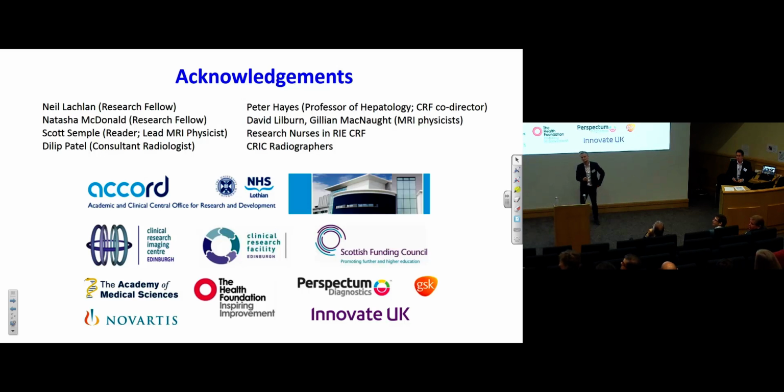Thank you for that. That was really interesting. I was just interested, you started off your talk mentioning the limitations of liver biopsy for misclassification of patients, and then you went on to talk about, if I understood it correctly, a diagnostic accuracy study of this multi-parametric MR using the same flawed reference standard. How do you know you have classified your patients correctly, and therefore how accurate do you think your results actually are?